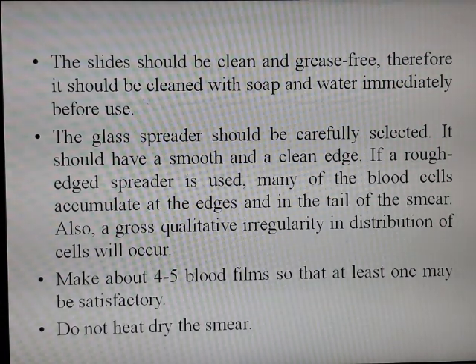The glass spreader should be carefully selected, and also the slides should be dry and clean. They should be dried nicely. It should have a smooth and clean edge. If a rough edge spreader slide is used, then many of the blood cells accumulate at the edges and in the tail of the smear, and ultimately gross qualitative irregularity in distribution of cells will occur.